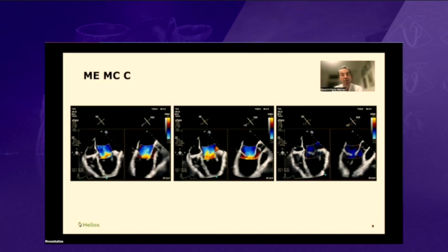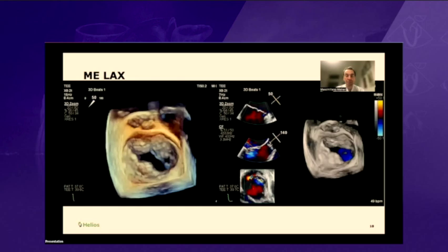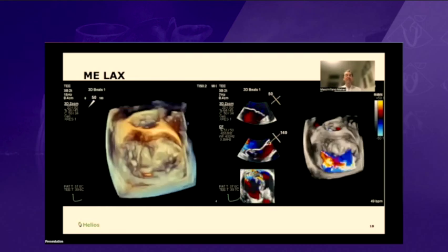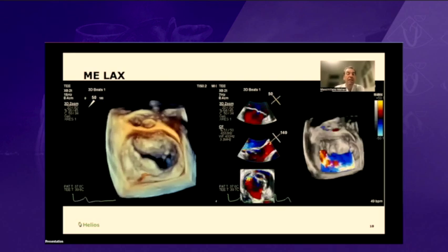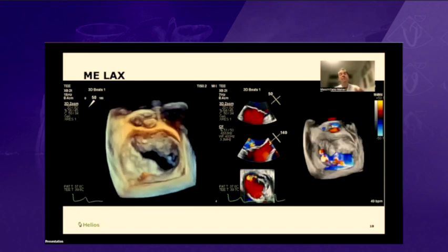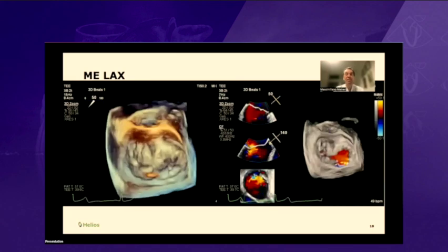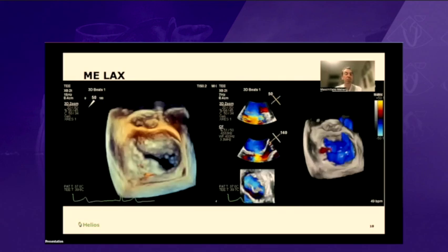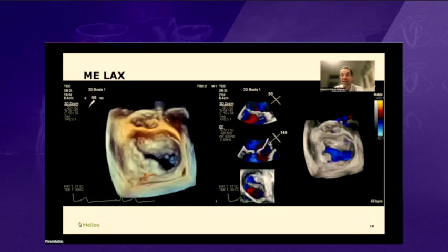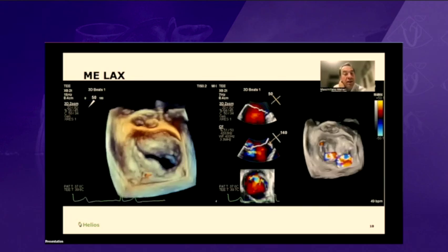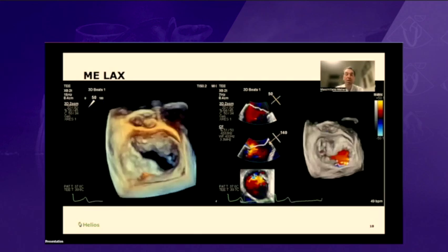As we move medially, there's a bigger jet with a small posterior mitral valve leaflet, which is restricted with no real anterior valve prolapse. On 3D, you can see this is a valve where almost everything is prolapsing. We have anterior leaflet prolapse most pronounced in the A2 area, P2 prolapse, and A1 also prolapsing. But on the right side — medially — the P3 is not prolapsing; it's actually restrictive. The 3D color shows the jet coming exactly from the posterior medial commissure.